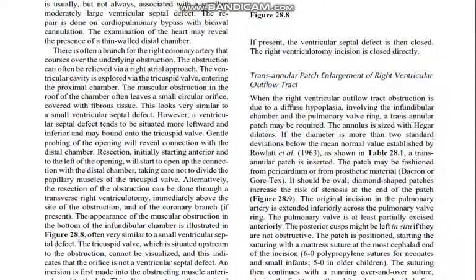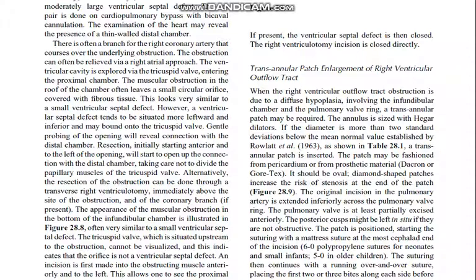The patch may be fashioned from pericardium or from prosthetic material, Dacron or Gore-Tex. It should be oval; diamond-shaped patches increase the risk of stenosis at the end of the patch.